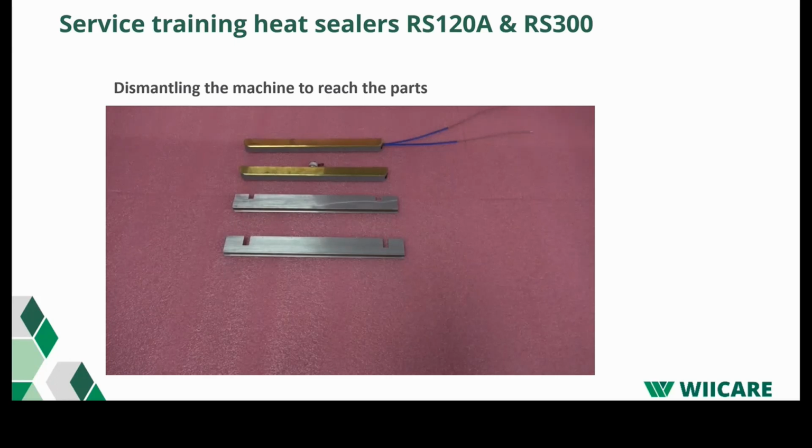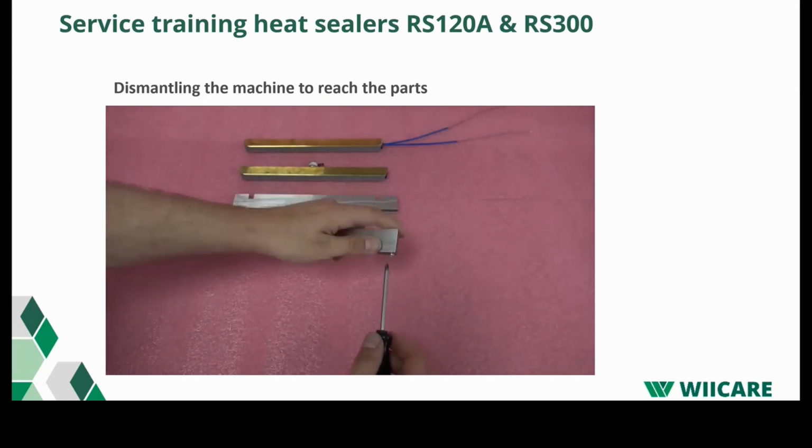If the Teflon tape is worn or damaged, it must be replaced. I start with the guiding bar. Unscrew the screws and remove the old tape.